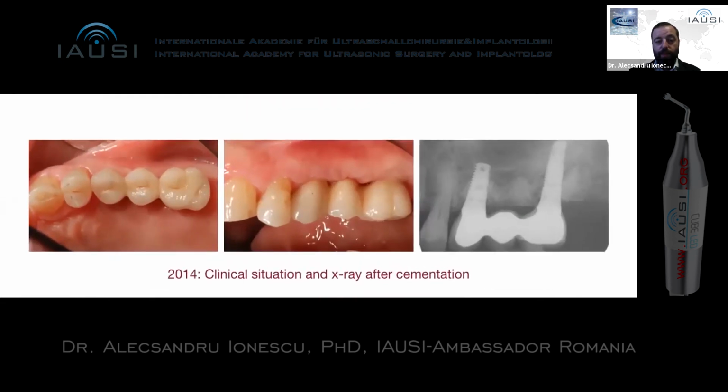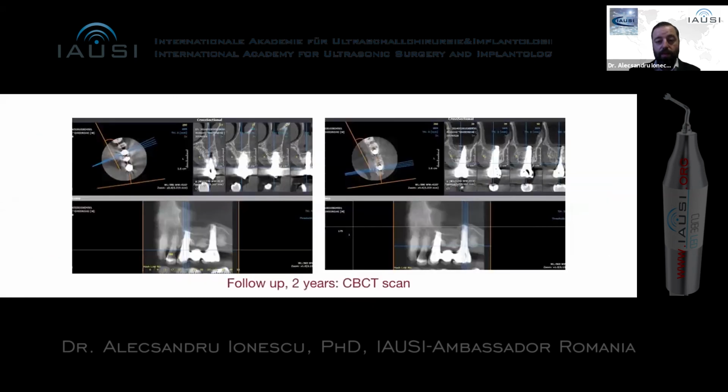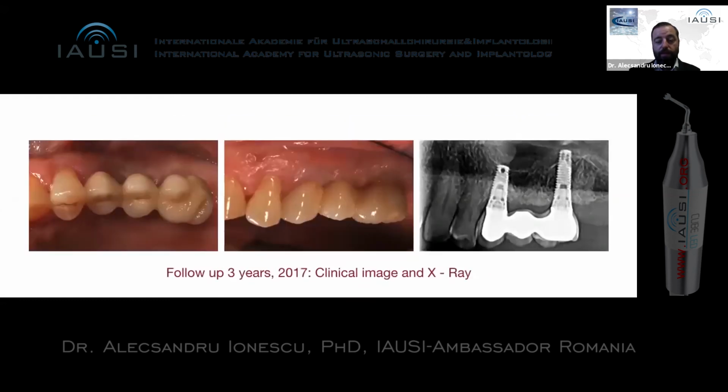Now, this is the situation after cementation, then 2 years. It's a CBCT scan on the right image, that is why it looks like this. But on the CBCT, you can see that everything is very fixed, fast, and stable. Here again in 2017, it's 3 years.